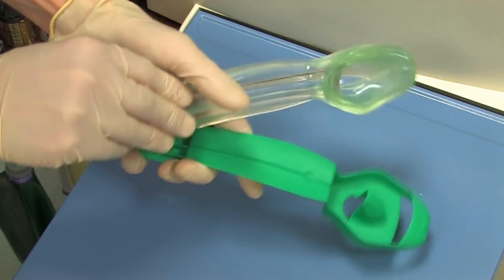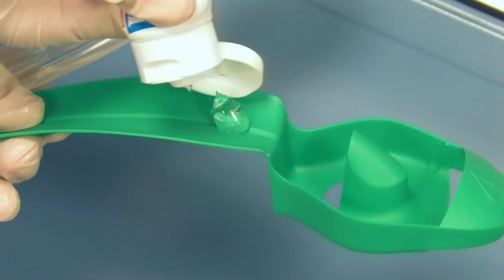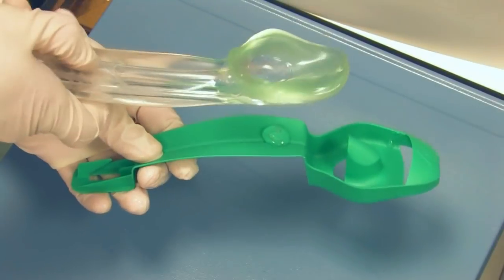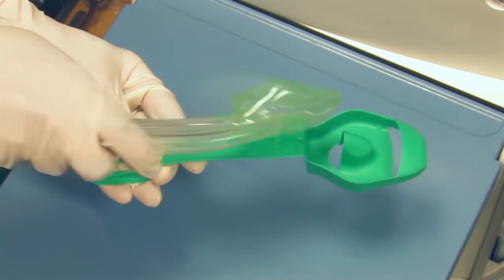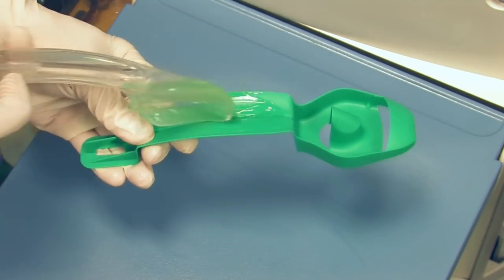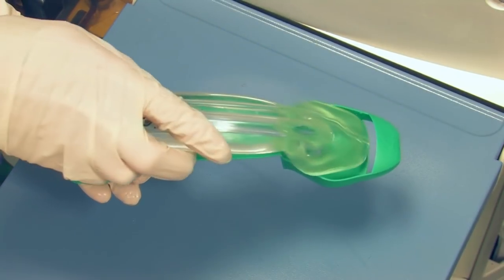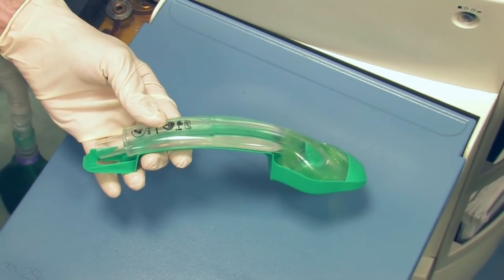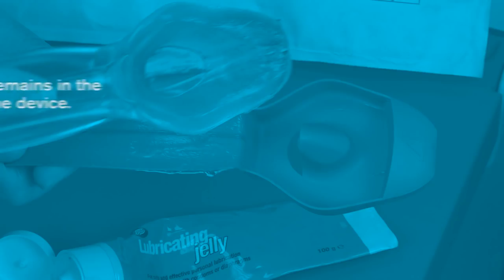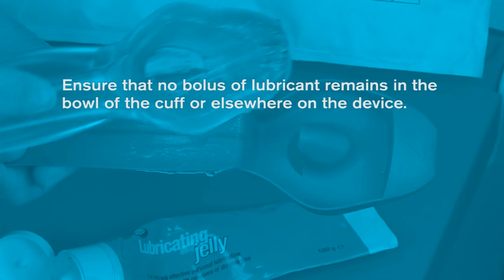In the final minute of oxygenation, the supraglottic airway should be lubricated according to the manufacturer's instructions. With the iGel, it is particularly important that the device is lubricated on all four sides of the cuff and not just on the tip and posterior surface. Do not use silicone-based lubricants. After lubrication has been completed, ensure that no bolus of lubricant remains in the bowl of the cuff or elsewhere on the device.